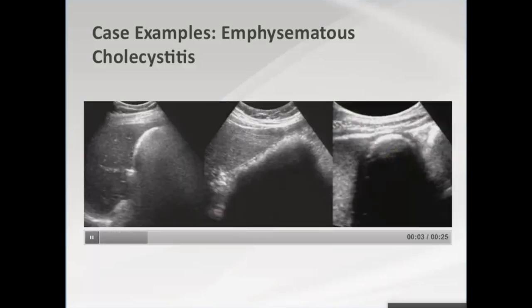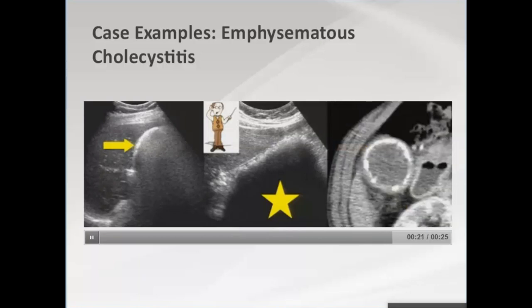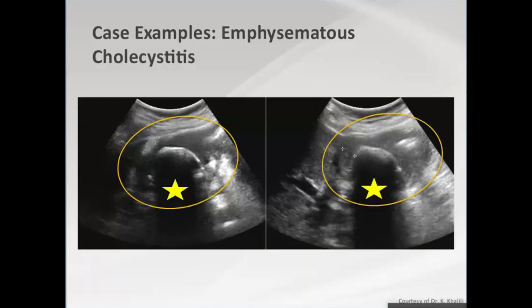A third gallbladder to consider: the wall looks similar to the emphysematous case, but the teaching point is that the shadow is the important feature. Here the shadow is one of calcium — this is a calcified gallbladder wall, a porcelain gallbladder.